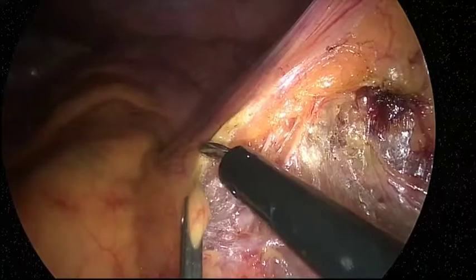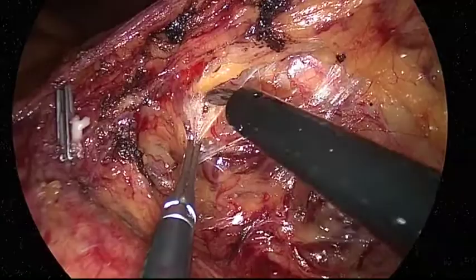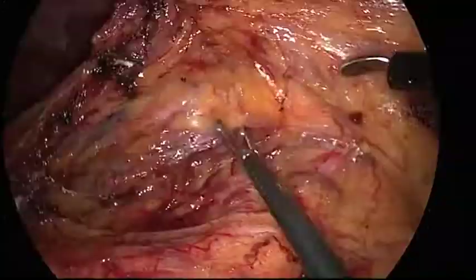The root of the inferior mesenteric artery is exposed and cut using an ultrasonic device after clipping. Retroperitoneal dissection proceeds laterally. At this point, the left ureter and gonadal vessels are identified and preserved.